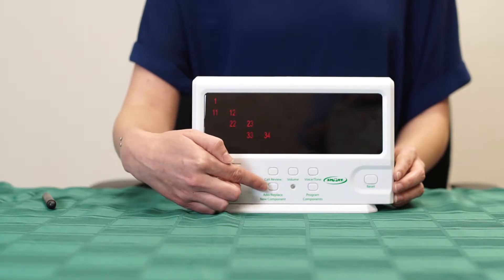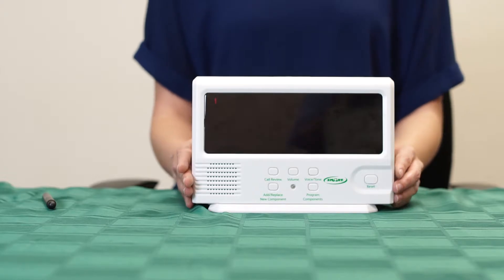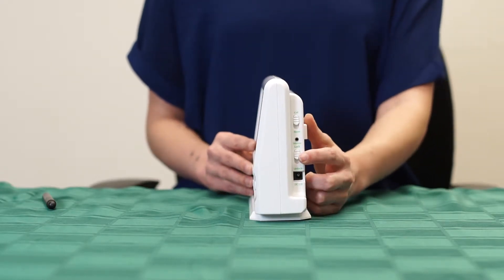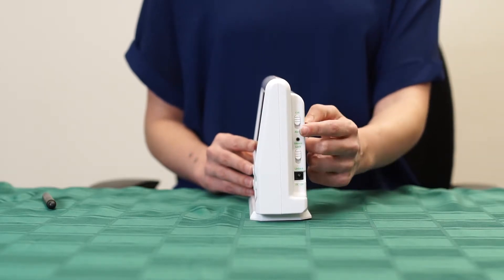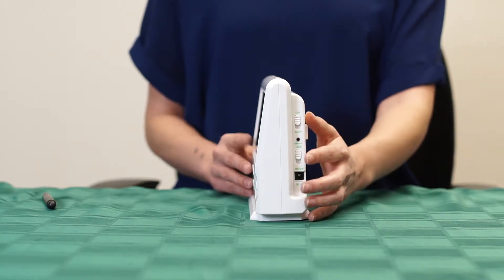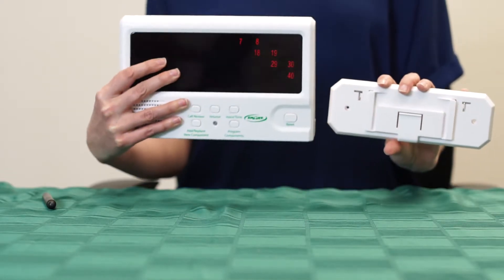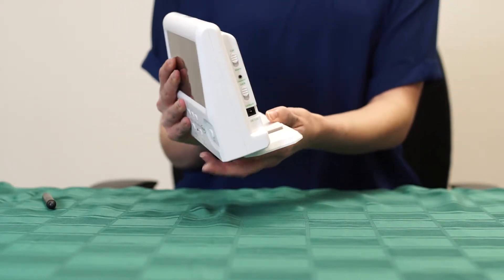The new components and program components buttons are used for programming components into the central monitor. The lock/unlock switch should be kept in the lock position unless you are programming the central monitor. The call/alarm switch will turn the sound of the central monitor to either the alarm noise or one of the various call alerts. The base of the monitor can detach to create a mounting bracket for the back so that it can easily be installed onto a wall.